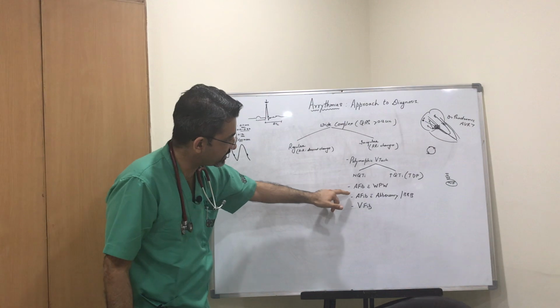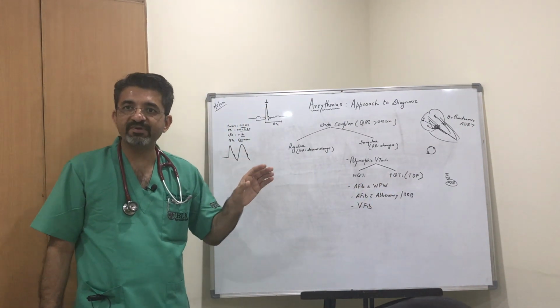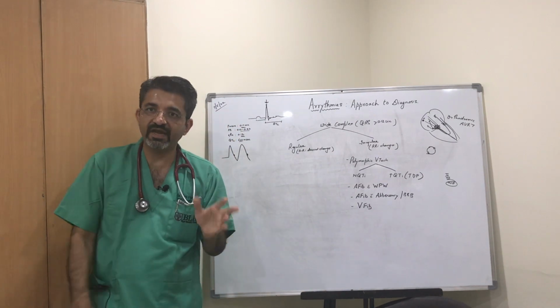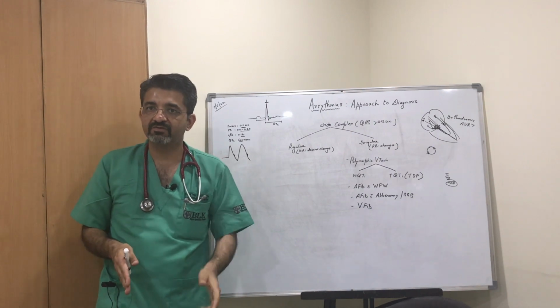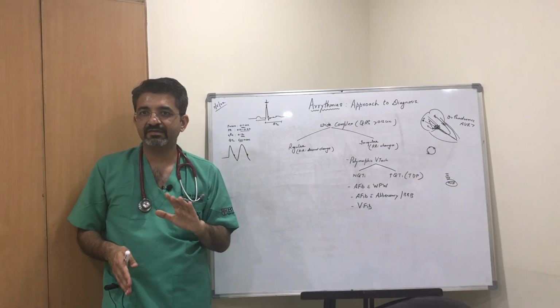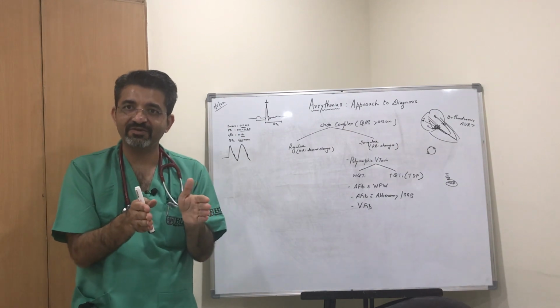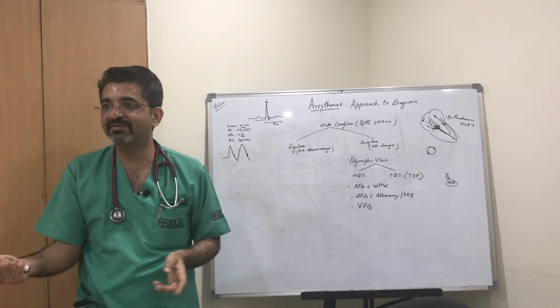Now how do you differentiate AFib with aberrancy? See, what's happening is you have an atrial rate of say 350 and you have a bundle branch block. It's a block which is permanent. So the morphology will be the same. It won't vary. You got the point? It's a very fine point that if you have a block, you have only one other way to go. So the morphology will remain the same.